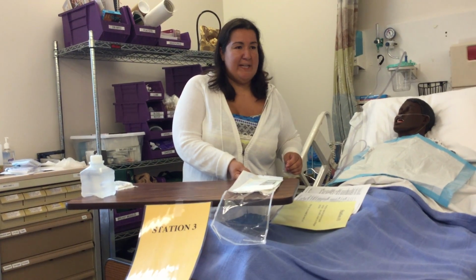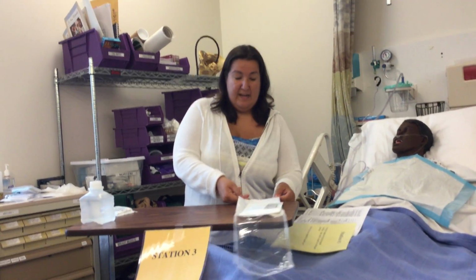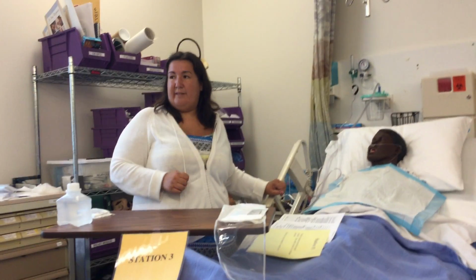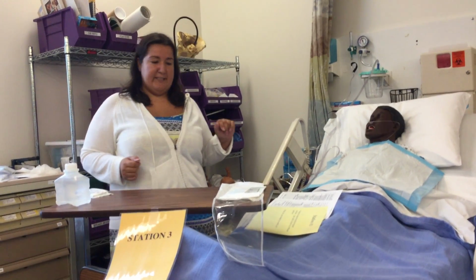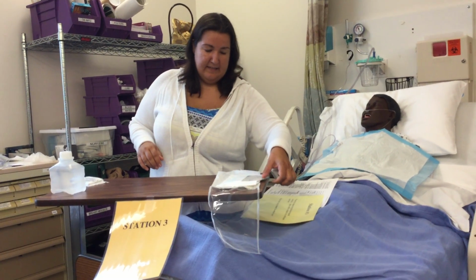And can I touch the outside of this package? The outside? Yeah. Like this? Or within the borders? Yeah, I can. And even if this comes off slightly, the sterile stuff is still inside. So even if that touched the table, it's not a big deal at this point. Now if your catheter touches the table, then it's a big deal. But right here, if it slides a little bit off the package, it's not a big deal because the sterile stuff is still inside. Make sense? Mm-hmm.